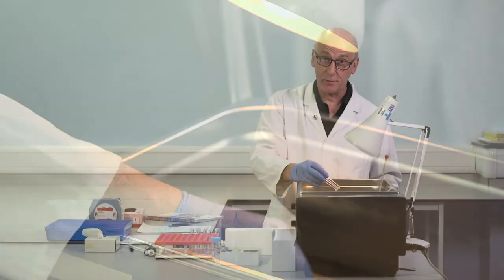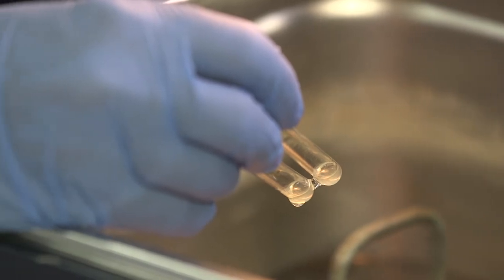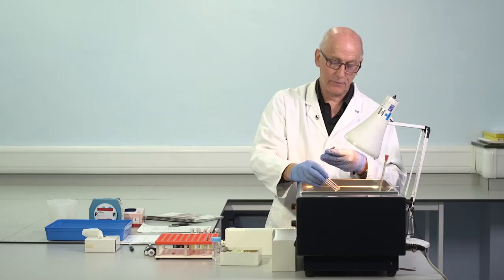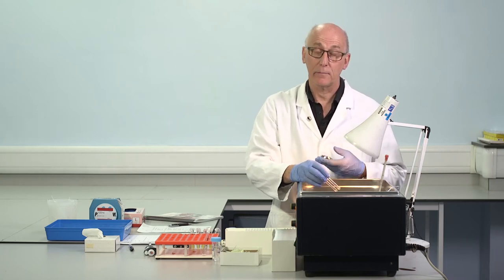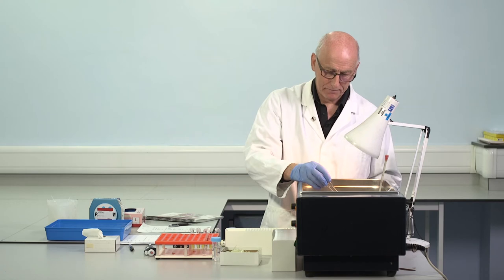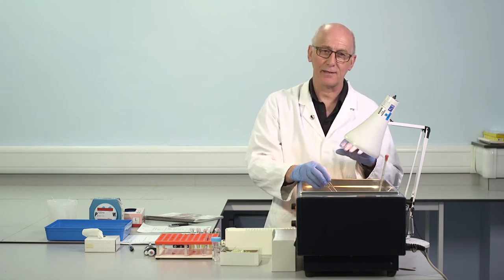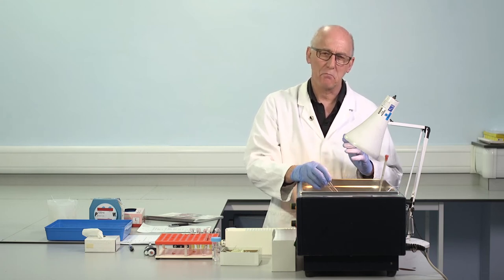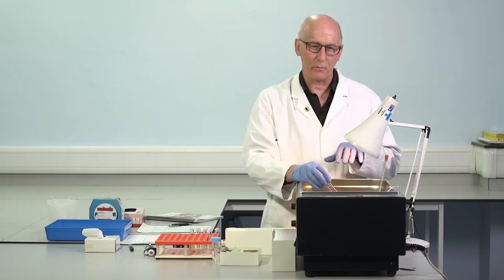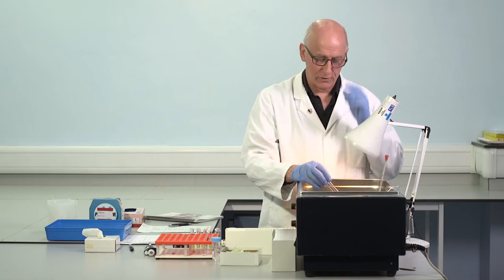The two clotting times we've obtained, 44 seconds, 44.4. So the first question, are the duplicates similar? Yes. Typically, we would see a difference here in a manual test at this kind of level, ideally less than 1 second, might be a second and a half, just could be up to 2 seconds, but we hope for that kind of precision where we've got very similar results.